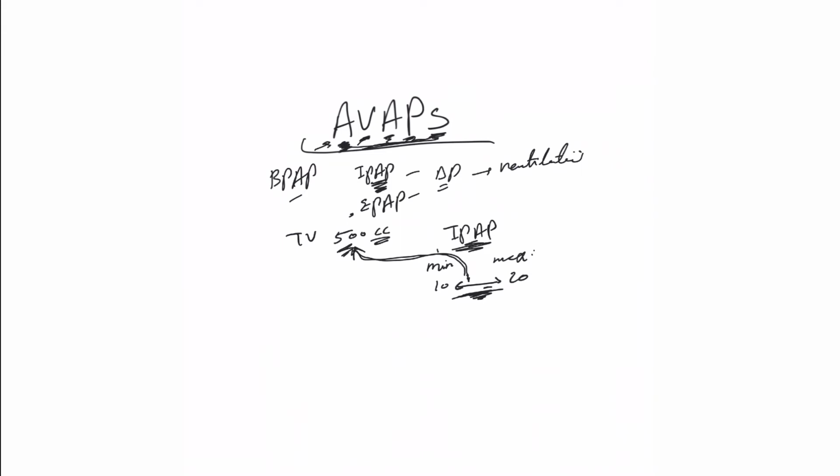And this can be very helpful because with fixed IPAP and EPAP, you have to manually adjust based on the tidal volume, but this one is smart, right? So whenever there is a questionable situation and you want to be sure of the ventilation, this would be a great option, like COPDers, neuromuscular disorders like muscular dystrophies, motor neuron disease, restrictive lung diseases like scoliosis. All these will benefit from this mode of ventilation. So that's how it works.